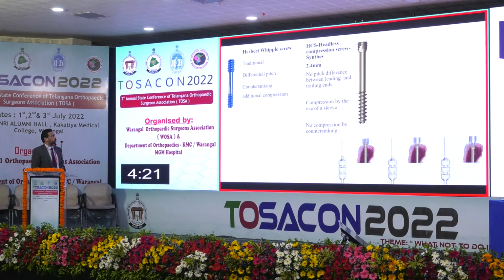If you see the Herbert screw, which is a locally made Indian screw, it has got a differential pitch. The leading pitch is larger than the lagging pitch. So you get compression by countersinking the screw. If you see the HCS from Synthes, there is no pitch difference, and compression is by the sleeve actually. You can see that sleeve which is being used, and once the sleeve is loaded onto the screw, it becomes a lag screw, and you just have to bury the screw. So the countersinking doesn't give any compression for this HCS screw.